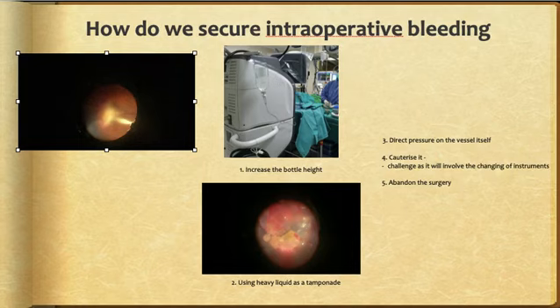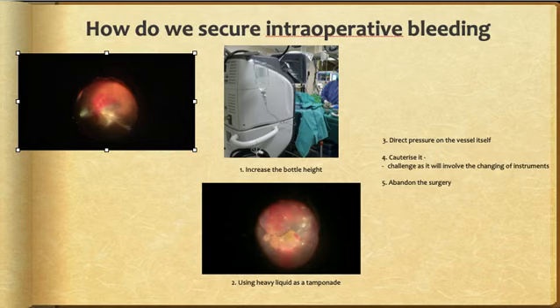So furthermore, there will also be a delay from the occurrence of bleeding to the cauterization. What happens is, frequently by the time we want to cauterize, there will be a pool of blood covering the bleeder site. So then it creates another cycle of rebleeding.